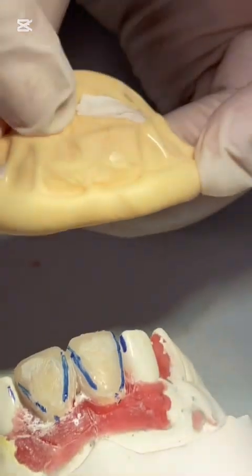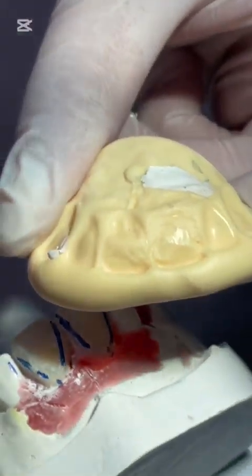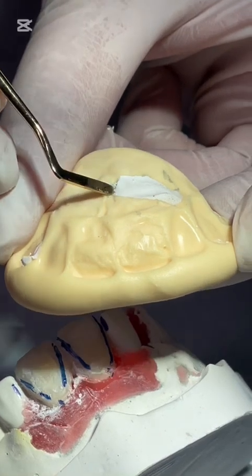Okay, now I have an index. I have a reference. So I can use this reference to make my permanent restoration. Okay? This is what we call a silicone index.